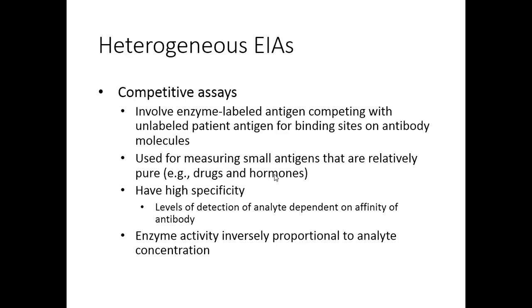So we just talked about general information about the EIAs, and now let's talk about competitive heterogeneous EIAs. These we've done. We've just talked about these when we talked about all those competitive assays. So again, we're going to kind of cruise right through.